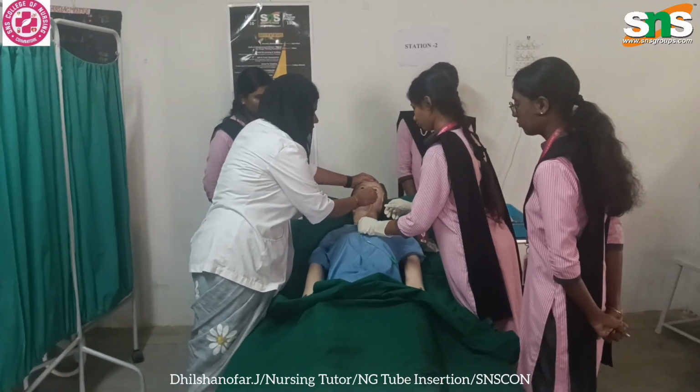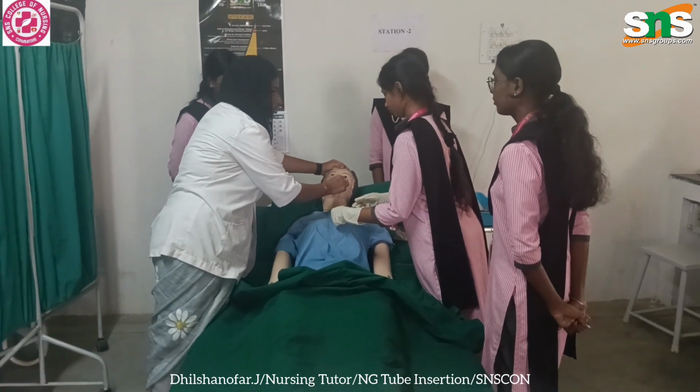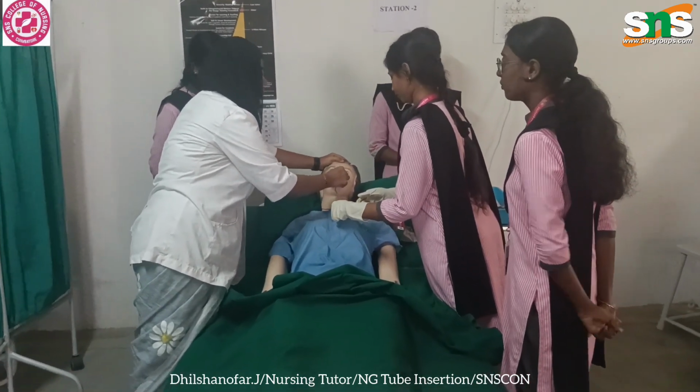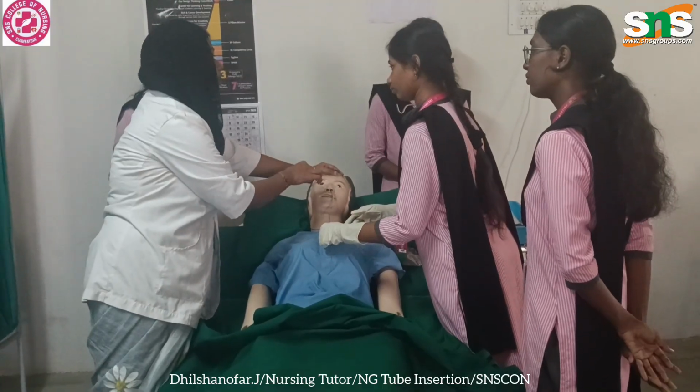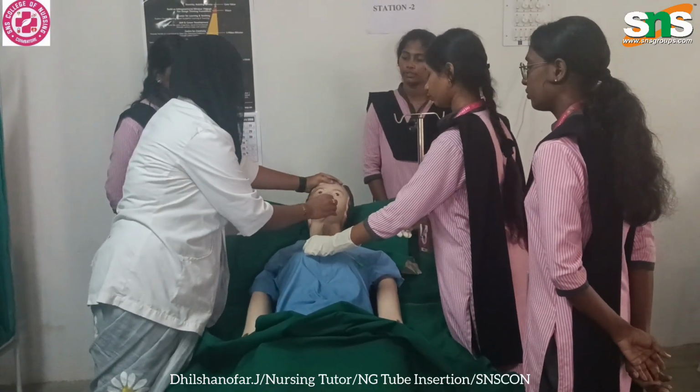Until the marked site is reached, you have to insert the tube. If you face any obstruction during the insertion, what do you have to do? You have to stop the procedure.